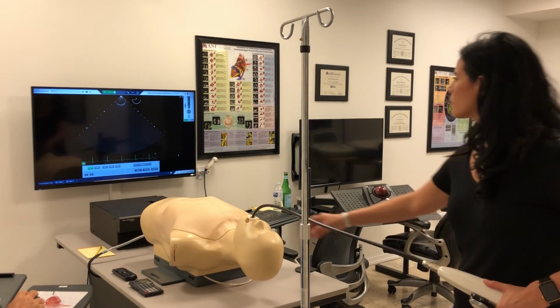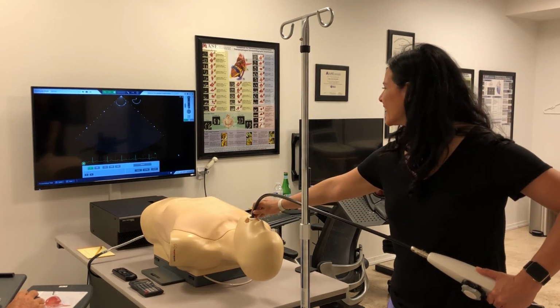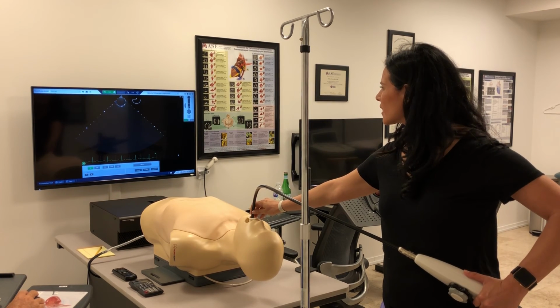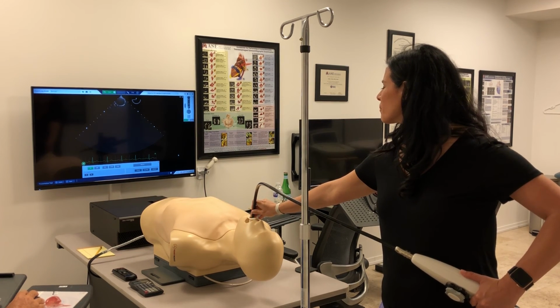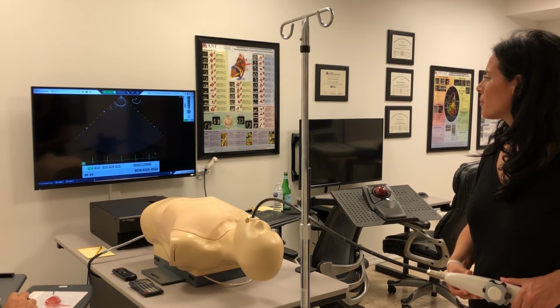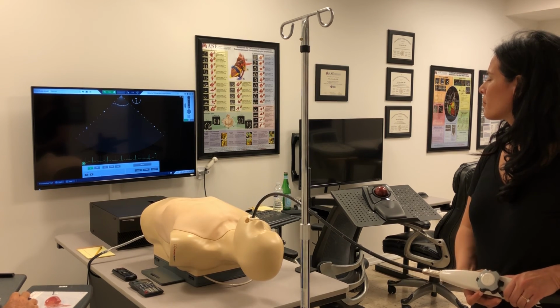Good. That started out as a right turn, but then you realize that the vena cava is over in the right side, the aorta is over in the left side, so you reversed it nicely. Here's the mid-esophageal aorta in short axis. Now you want to develop the long axis view. So if the short axis is at zero, go ahead and develop the long axis. You know it's going to be at 90 degrees of omniplane.